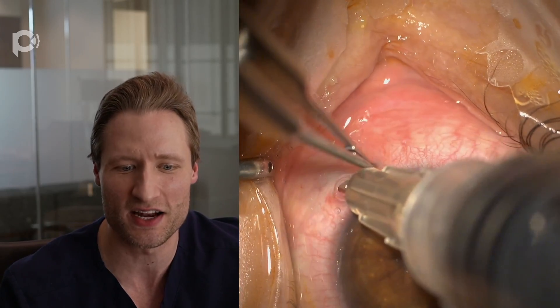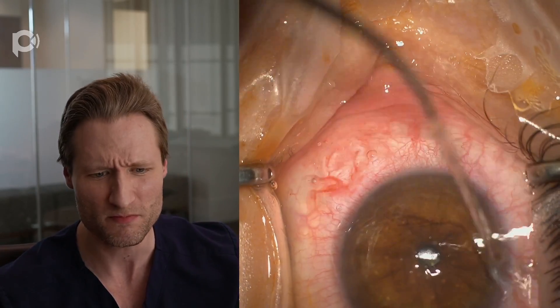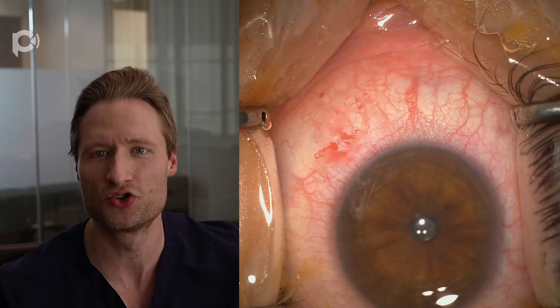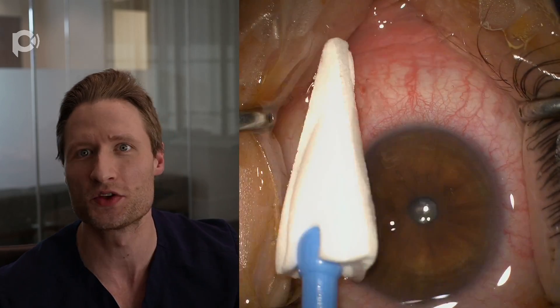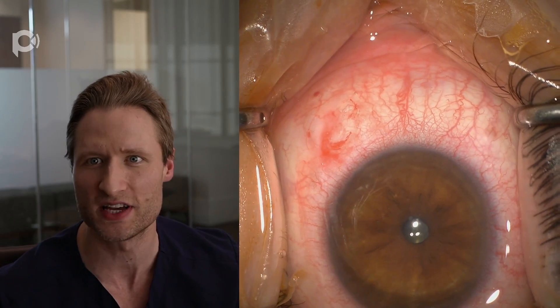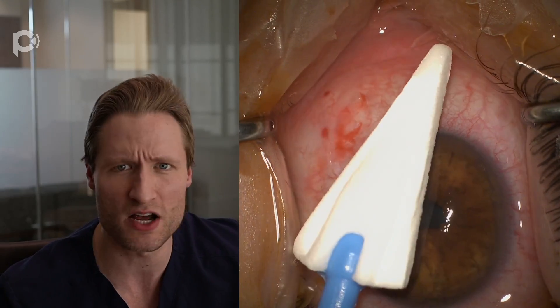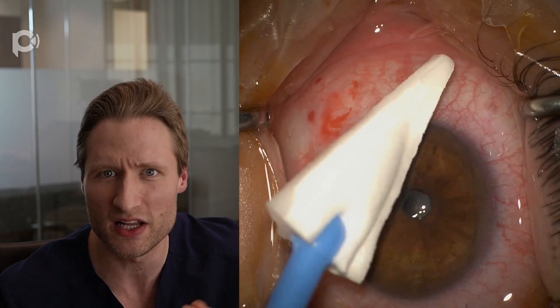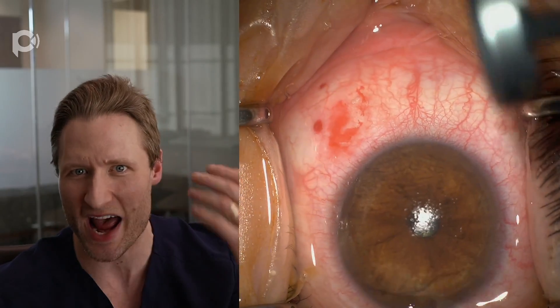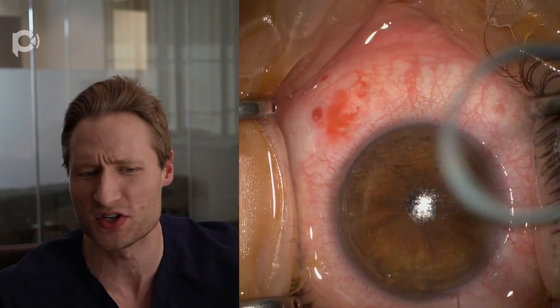Here comes our subtenons anesthesia — just one cc down in the infranasal bulbar quadrant of the eye. Once that's done, I'll rinse the surface of the eye off, and that prepares us to dry the corneal surface with some Maricel sponges. I like Maricel as opposed to the normal compressed cellulose of a Wexcel spear, because the compressed cellulose of a Wexcel is kind of crumbly and you can get bits of it into the corneal channel, which are annoying to see after the operation. So I use a Maricel sponge, which is not friable.